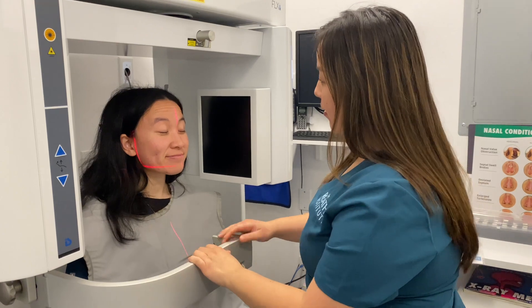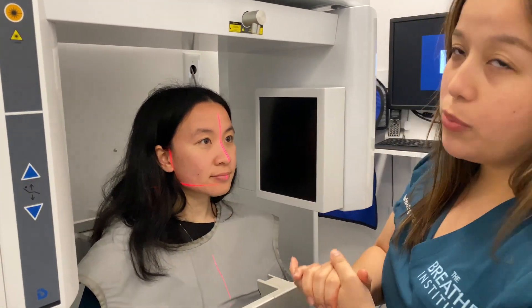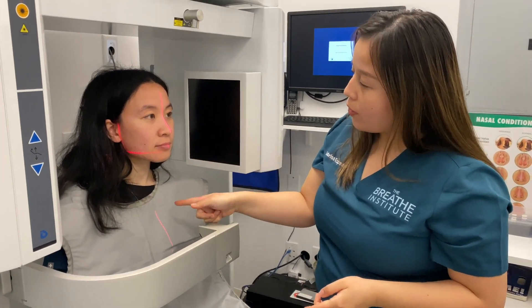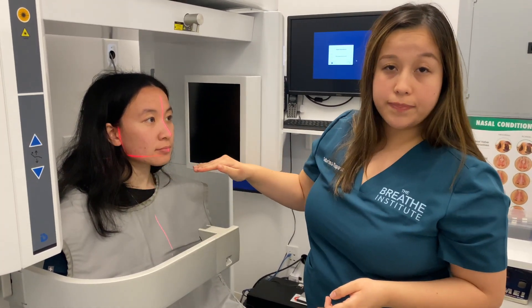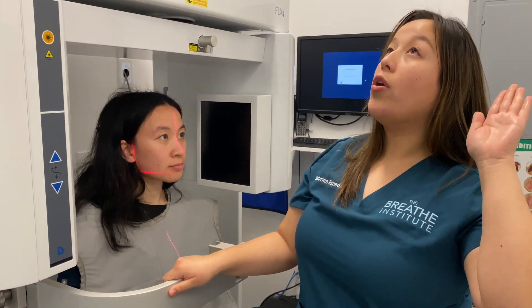Sam, is it okay if I move your head? We're going to go ahead and move your head this way. As we can see, Sam now has a good vertical line and a good horizontal line. What we're going to do next is make sure on this side that Sam is not over-extending her head backwards or not extending her head forward. It is important that we confirm that patients are not over-extending their heads back or tilting their head forwards, as that can alter the size of their airway.